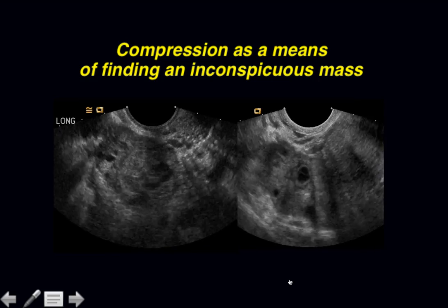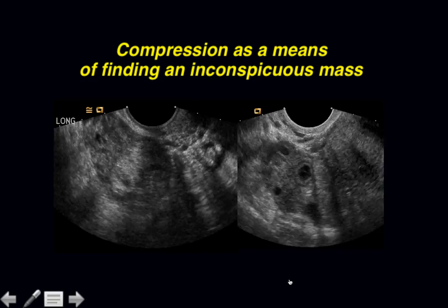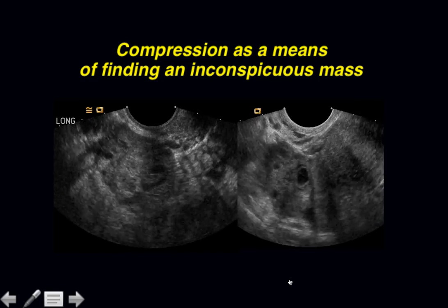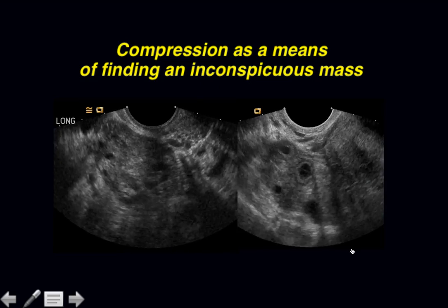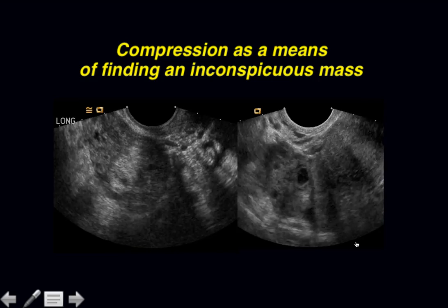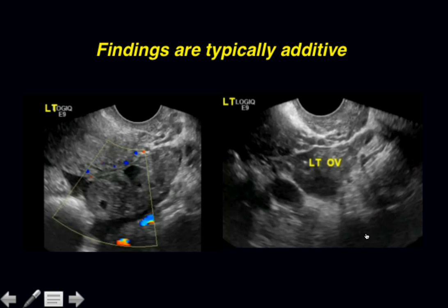So compression has a variety of useful adjuncts. Helps to separate masses in the ovary from masses separate from the ovary. Helps us to see inconspicuous masses from time to time. And also, the patient will frequently complain, ouch, that's exactly where it hurts, doctor. So, again, we are interested in finding masses that are separate from the ovary.